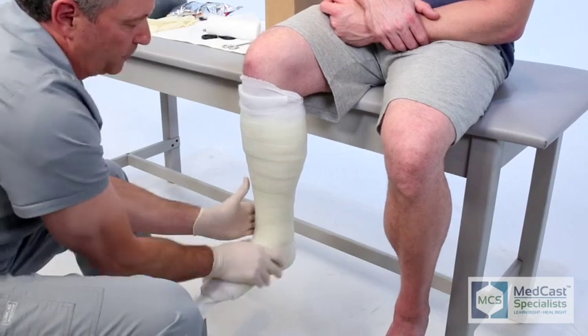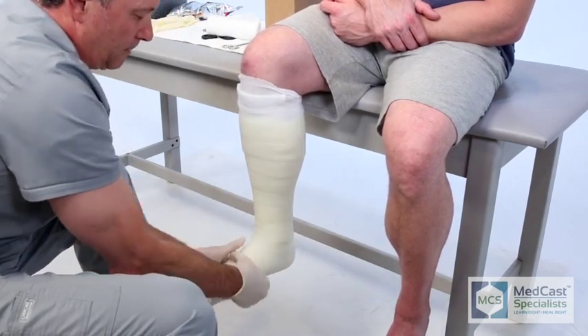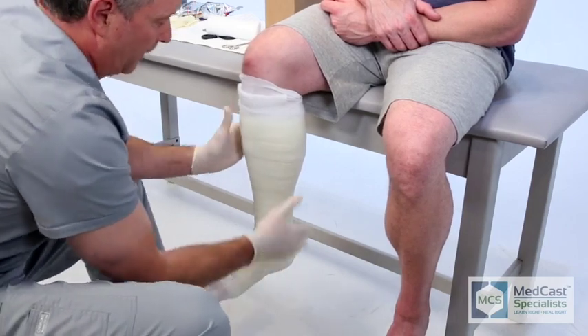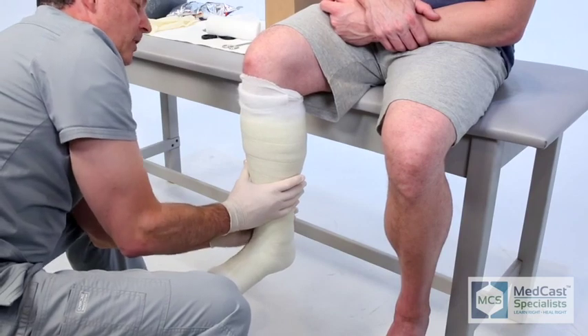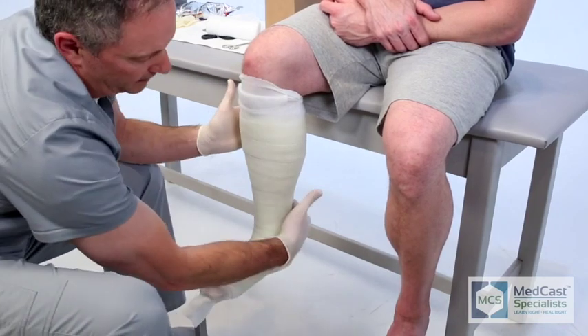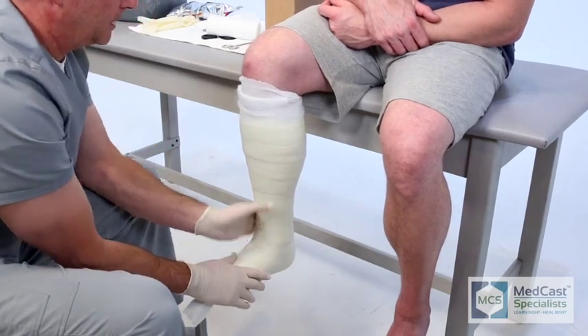That's another weak spot of any short leg cast — right around that Achilles area. If you take the patient off the stand too early, they'll have a tendency to let their foot drop. If you're not paying attention and constantly feeling back there, you'll see a wrinkle, but if you reinforce it strong enough, it usually will resist the wrinkle.